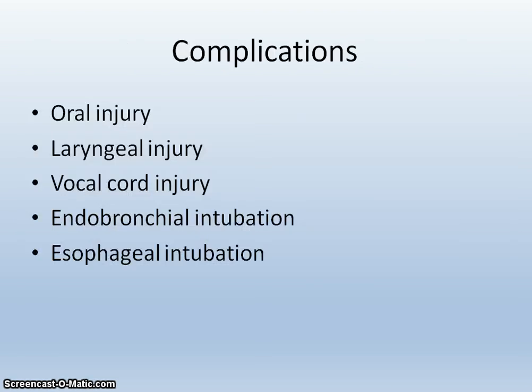Now, these are some of the complications of endotracheal intubation that you have to observe. One is oral injury, injury to the mouth, lips, or even breaking of the teeth, if the technique is not done properly.